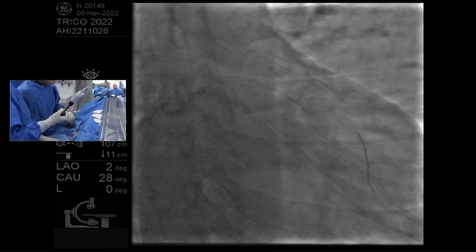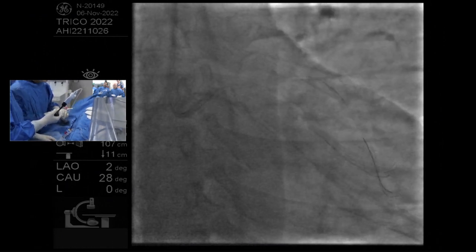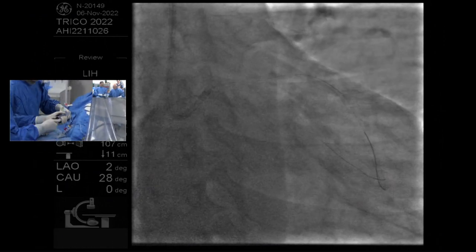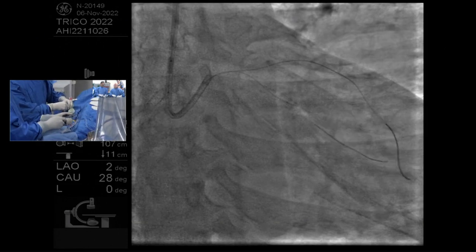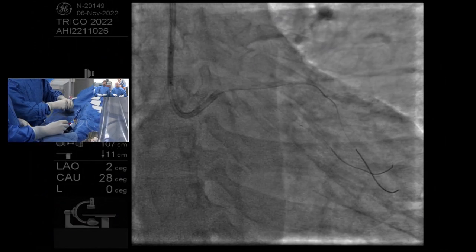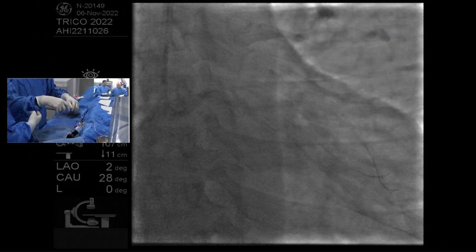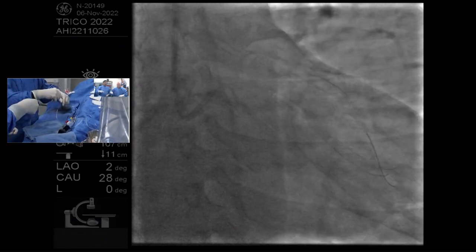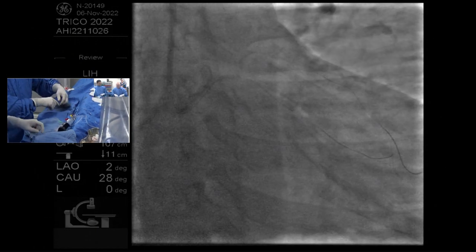That being said, Ryuri balloons are magical balloons. We don't have access to those in North America. I think in the U.S. they have Takerus. Yes. But the Ryuris are particularly well constructed. They're very strong balloons, and they have a slip coating on the outside, the same sort of hydrophilic coating that the sheaths do. It's very impressive where they will go. I think the 1.5 Ryuri or Takeru balloon is a staple workhorse as part of any CTO toolbox where you can access that.